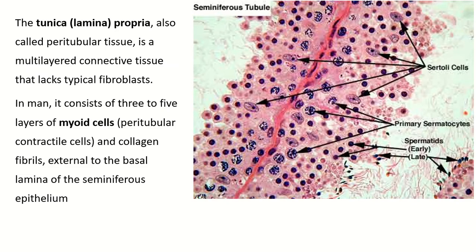This is the cross-section of the seminiferous tubule. This is one seminiferous tubule, and this is another seminiferous tubule. This pink layer is the tunica propria, or connective tissue layer, which is present outside the seminiferous tubule.